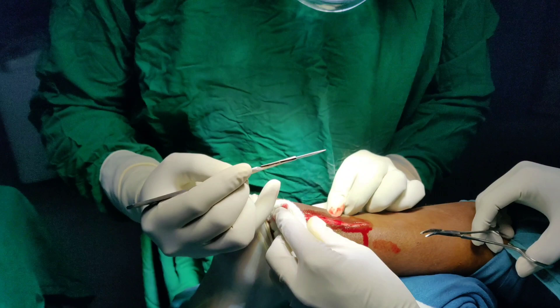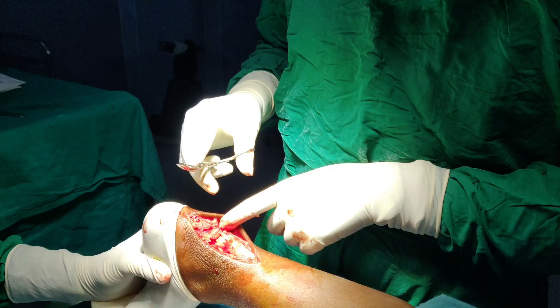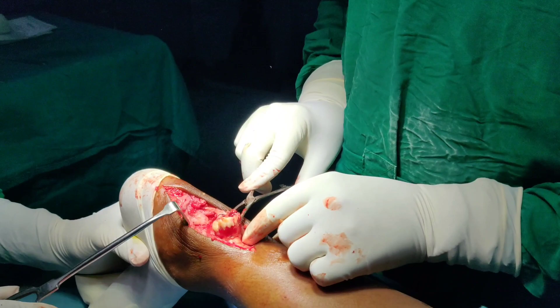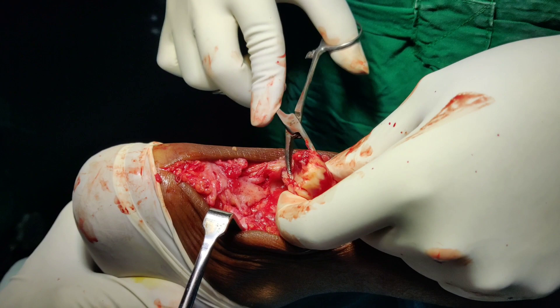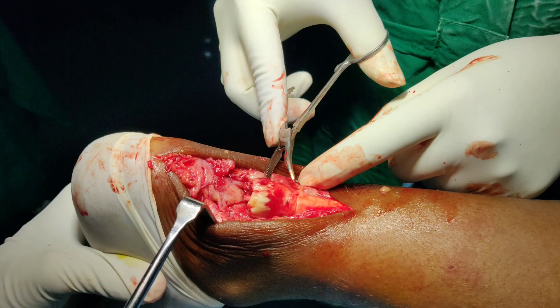Here is the superficial layer in this area. After that I will dissect. Here is the cut — you can see. This is the proximal part of the Achilles tendon. This should show continuity. This one is looking like a chronic injury. The patient had sustained the injury more than one month ago — she was telling just 10 days ago, but after looking here I can say it is more than one month. Now I have confirmed with the patient and she is telling it is more than one month.